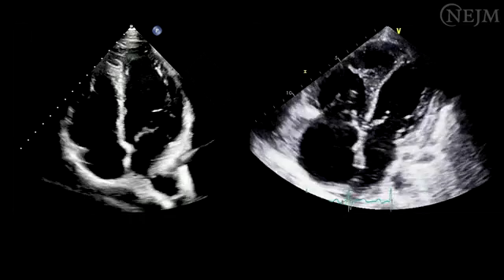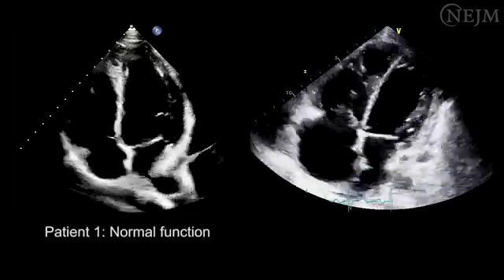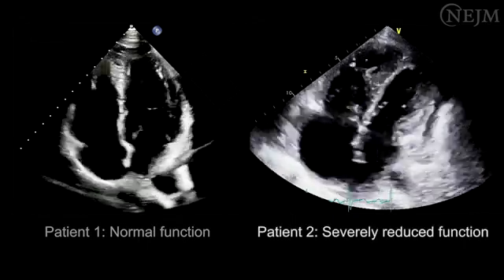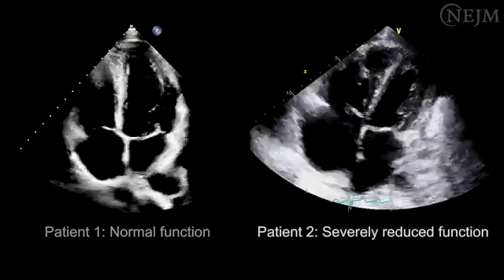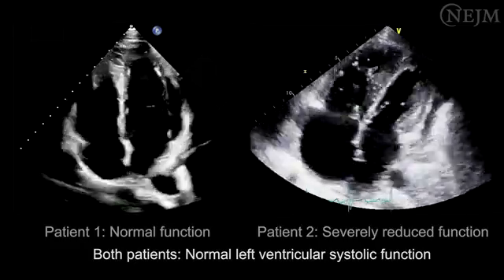This video shows images from two patients. Patient 1 has normal right ventricular systolic function, and patient 2 has severely reduced right ventricular systolic function. Both patients have normal left ventricular systolic function.